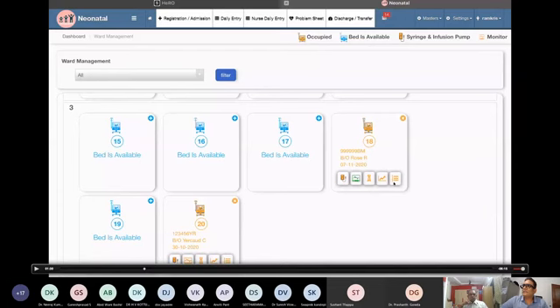The monitor is already connected, but the rest of the equipment is not connected. Now I'm going to work on the prescription, which is shown here. What happens now, we will see. Instead of writing the prescription by hand, I'm going to enter the prescription electronically in the software.